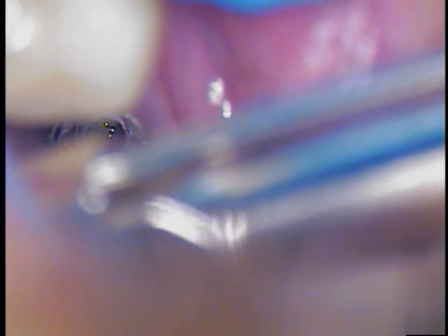This case was referred to me by a dentist out of Miami. I'm going to try to use an inverted cone — I've used several of them, going from a 33 and a half up to a 34 and possibly even a 35, just trying to torque in a counterrotational movement.